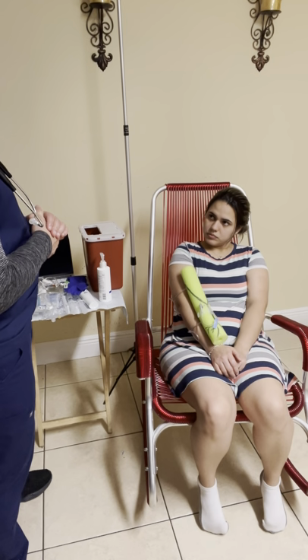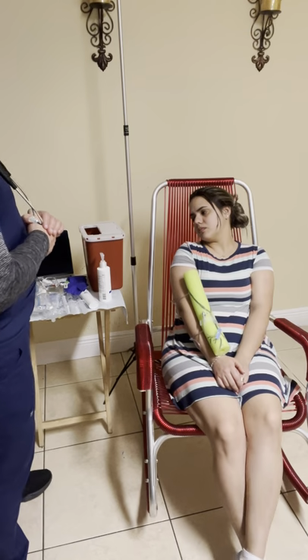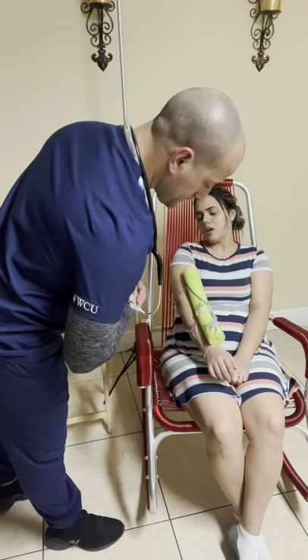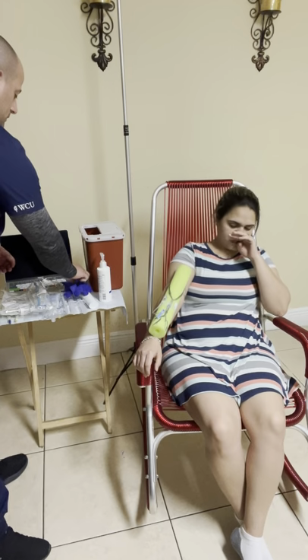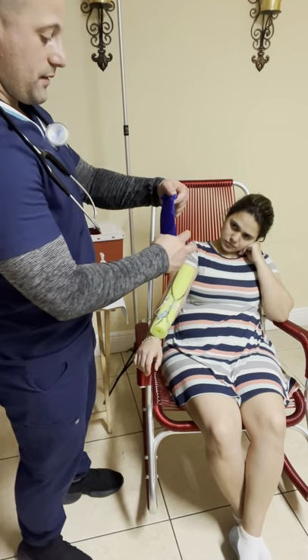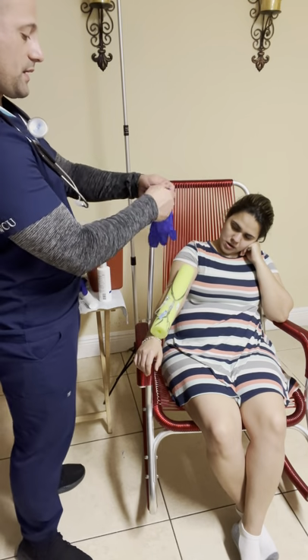Do you feel any pain, any discomfort? No? Okay. Do you have any allergy? No. May I have your name and date of birth? Rosalia Benedict. Okay, perfect. So now I'm going to ensure the patient's privacy and the patient's safety. I'm going to wash my hands.